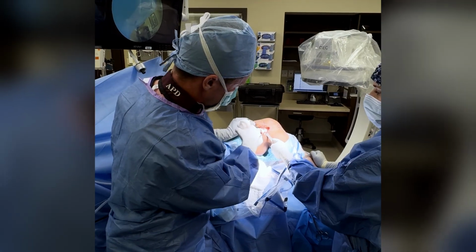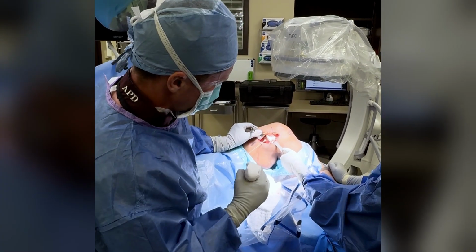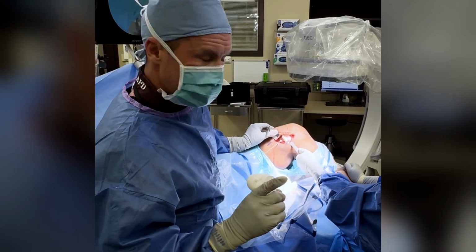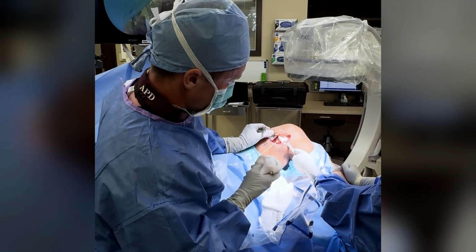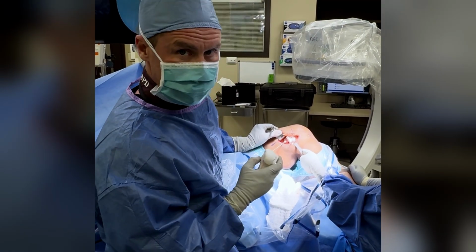So it's pinned into position. There you can see our cutting guide, which we're gonna make our osteotomy through. It's pinned in here. So that's step one, getting the guides in the exact position for our osteotomy. We're gonna take a quick x-ray and then make our cut.